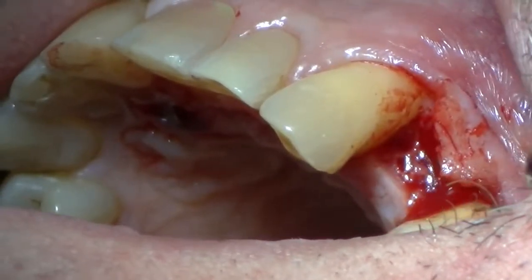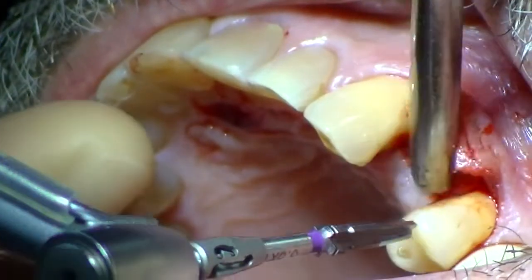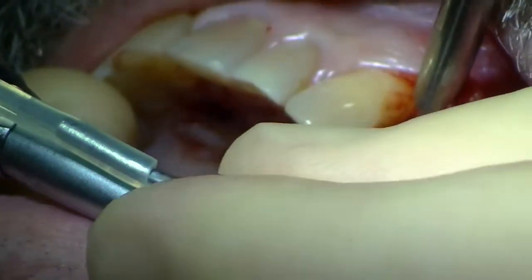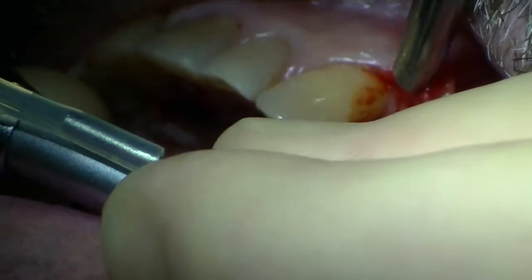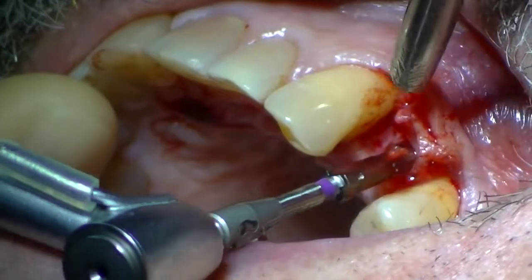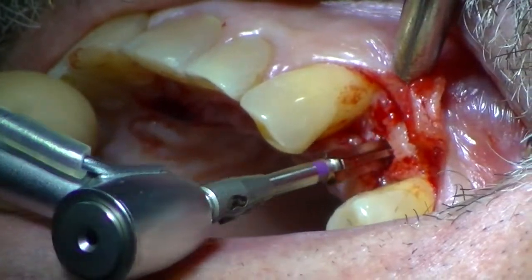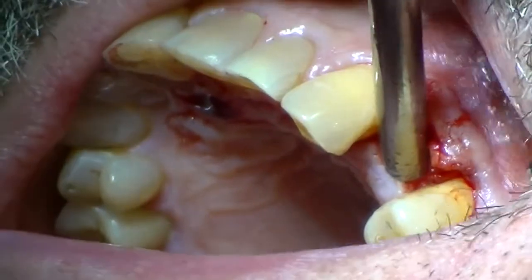I'm then going to take my final osteotomy burr, my 3.5 diameter. And again, back off just a little bit there, going to, yep. And you can see I'm at the crest of the ridge. Suction, please. Thank you. And basically that is my osteotomy.